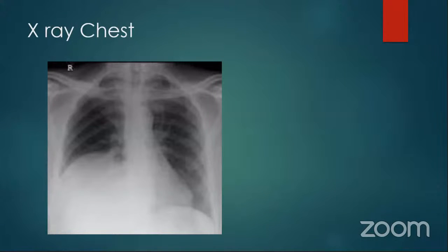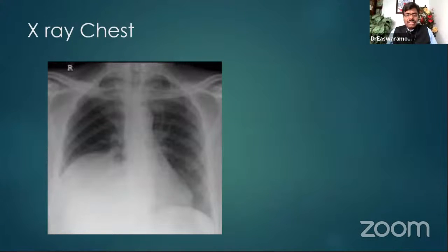Fever is a sign of infected collection. Take it from me, especially for a surgical person. Infected collection for you as undergraduates is always an abscess. So if there is something near the liver, it is a ruptured liver abscess or a subphrenic abscess. If you tell these two diagnoses, like ruptured amoebic liver abscess or subphrenic abscess or subdiaphragmatic collection causing sepsis and fever, the examiner will be very happy that you are on the right track. But if you are able to interpret the raised dome of the diaphragm by staring at the X-ray for a matter of a few seconds, that is excellently done.